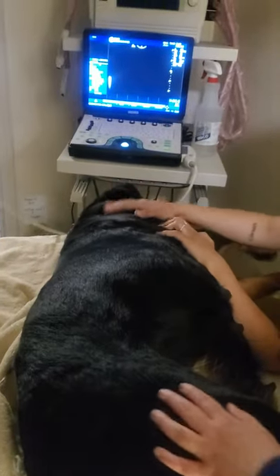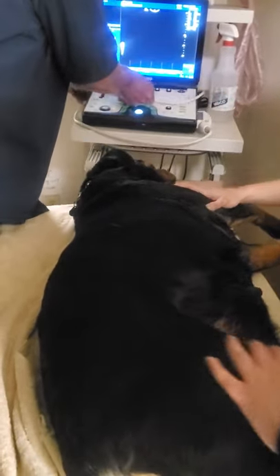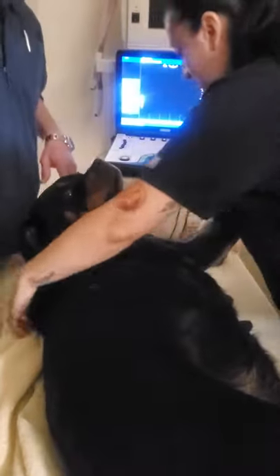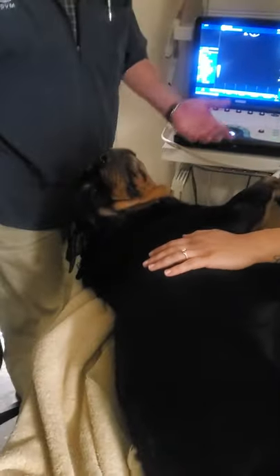She said, hey, we started at five — let's keep it at five. Everything's looking good, beautiful. The formation where you can see the spinal column, that's all appropriate for her stage of gestation. The heartbeat on each one of them is appropriate, so that's all good. Look at the big old mama — she's saying, what'd you get me into? Let's go!